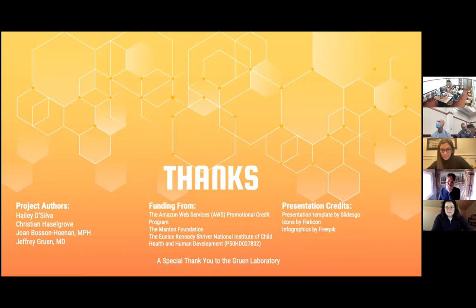Got it. Okay, and then this question, I don't even know if I know how to ask it. Because we're such a collaborative team, say I wanted to take some of this neuroimaging data that we're running through this and merge it to look at associations with behavioral data, which is typically what I do. I'm in the world of Mplus coding and creating latent variables based on behavior and reading, and motivation, of course. Is there a way to export all of these files generated in NeuroStack and use them? How are programs compatible is basically what I'm trying to understand for doing cross analyses.